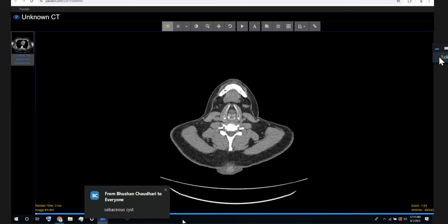So CT should not have been done. Well, technically, someone said here, technically no. I mean, they had said something clinically about a cyst on the back, but we weren't able to put two and two together. We didn't realize it was that big. Could we have saved irradiating the patient? Probably, but anyway, that's today's world, isn't it?